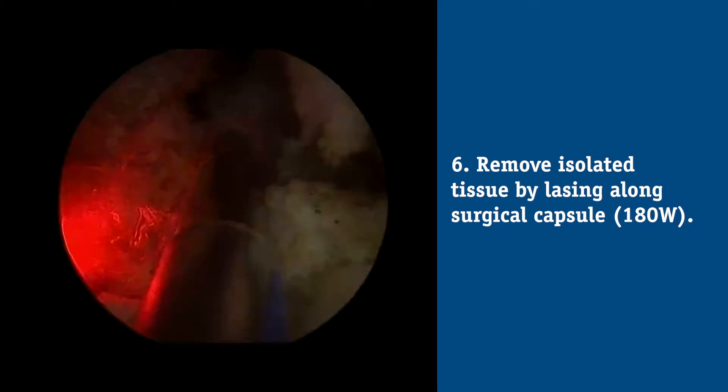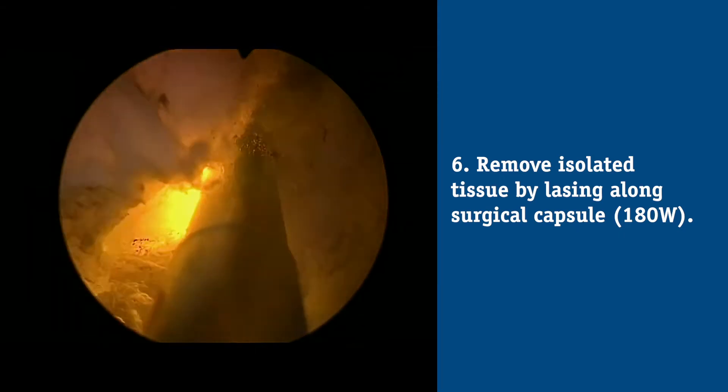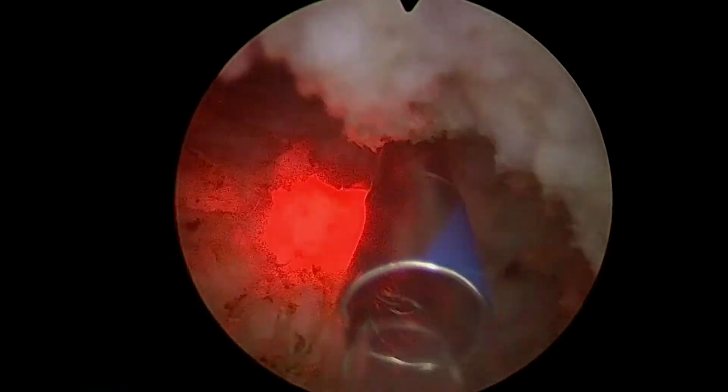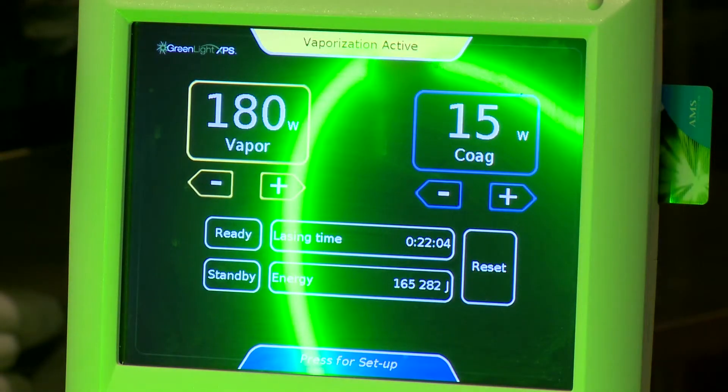If I'm going to wedge out a piece of tissue and release it into the bladder without using a morcellator, I have to use the laser to cut that piece into smaller pieces before releasing it into the bladder. After that, I evaluate the floor of the prostate, which is the central zone. If there's more than a 30-degree deflection between my verumontanum and trigone, I bring that down and continue to vaporize there until that tissue is gone — usually at 180 watts.